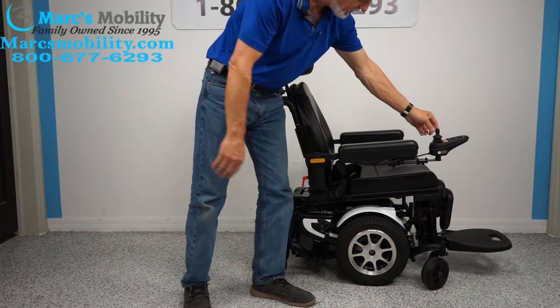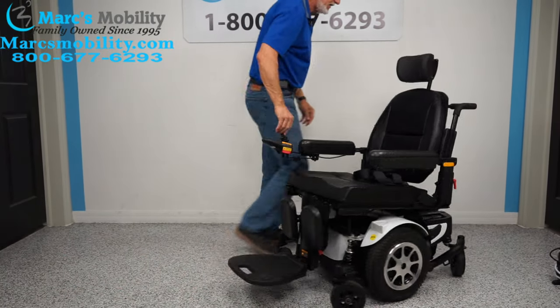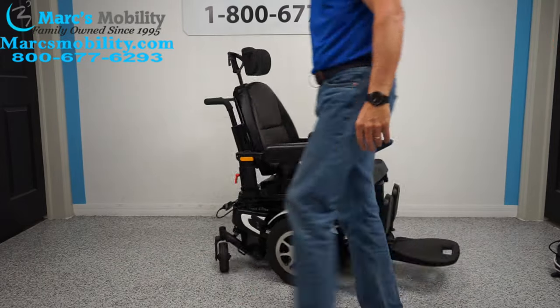It's a mid-wheel drive, so it turns on its own length. If you have this in the house, this is what you're looking at inside your home.